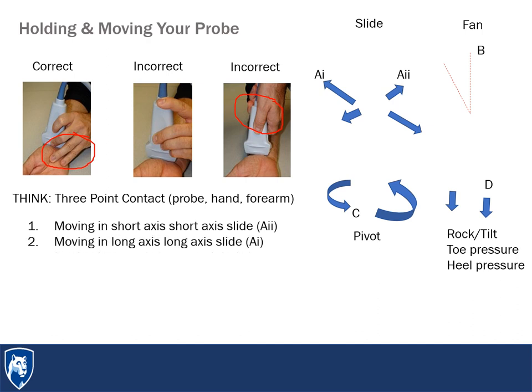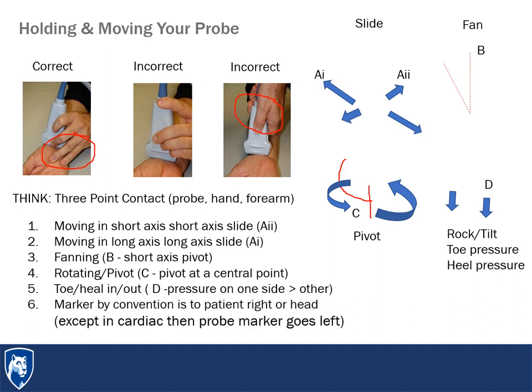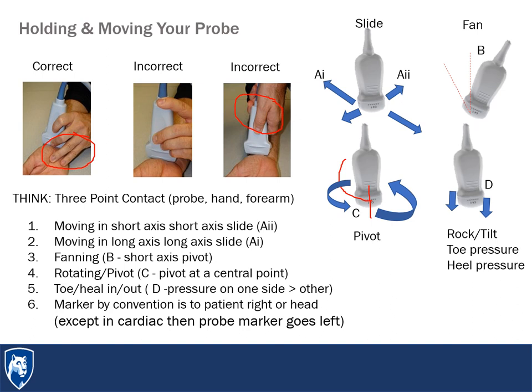The cardinal movements we'll see are a short axis slide or a long axis slide, which is along the short or long axis of the probe footprint. Fanning, which is pivoting the probe around its long axis. Rotating or pivoting, which is circling the probe around a center point. And then toe or heel pressure, which is in line with the long axis based on where the probe marker is. Heel is on the away from the probe marker. Toe pressure would be towards the probe marker.